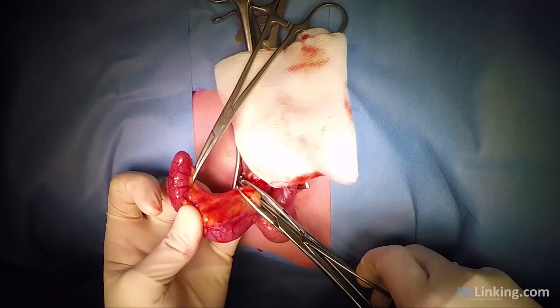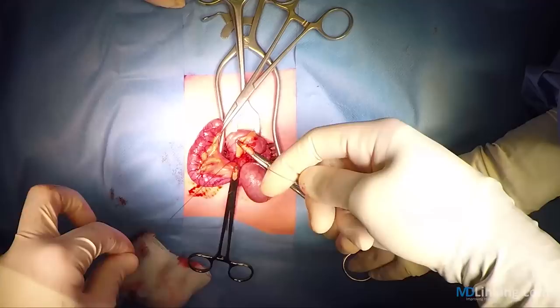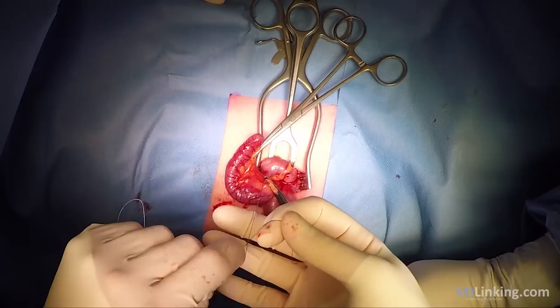It's also possible to divide the mesoappendix from the appendix itself with multiple steps, just following the mesoappendix along the appendix itself. But with multiple steps, if it's not too thick, you can be done with just one ligation if you selectively ligate it at the base.